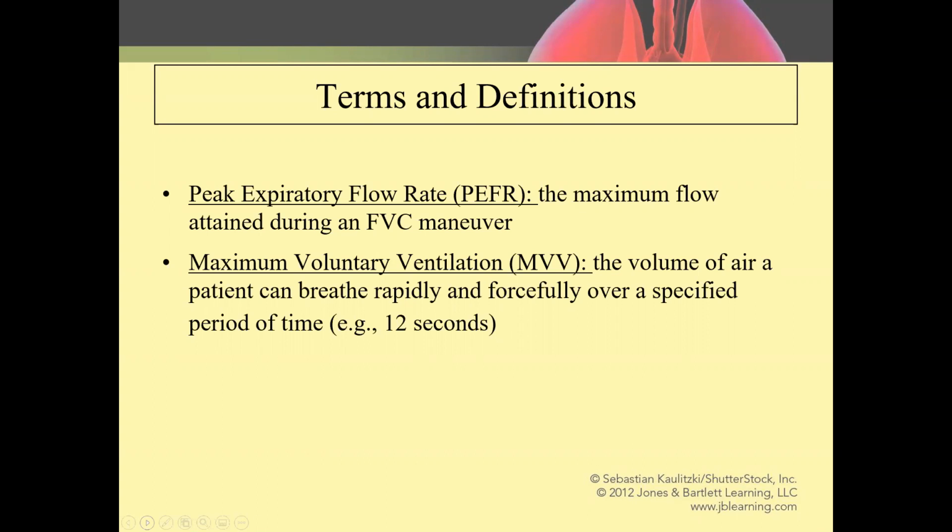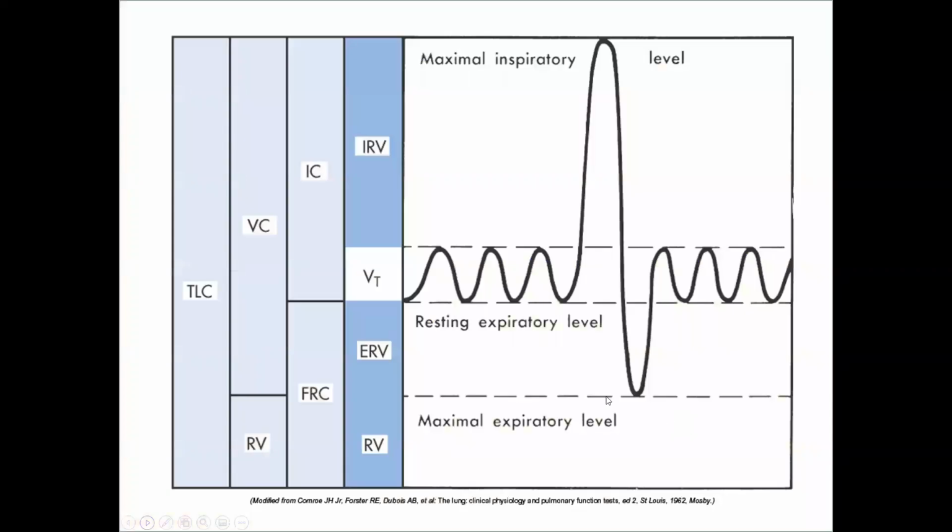simple, inexpensive, and valuable. MVV, I alluded to that earlier, is the volume of air that a patient can breathe rapidly and forcefully over a specified time, often 12 seconds. All right, so we're looking at the relationship here.